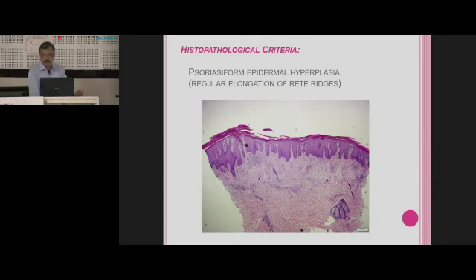Neutrophils in between the keratinocytes with spongiosis is also known as Kogoj's abscess, which is a hallmark of psoriasis, after ruling out the possibility of dermatophytes in the epidermis. This requires a special stain to rule out, because these abscesses may be secondary to fungal infection.